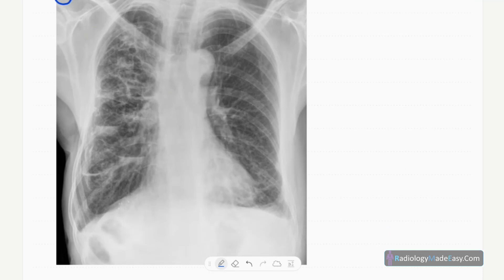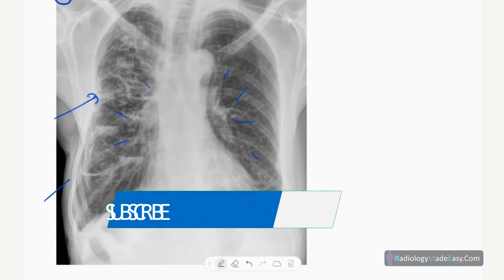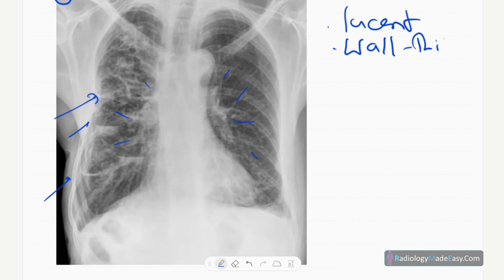You can see several abnormalities. There are prominent vascular markings here on both sides, and you can see multiple rounded lucencies — lucent areas that are rounded and have a thick wall. You can see the thick wall clearly, and some of them have air-fluid levels.